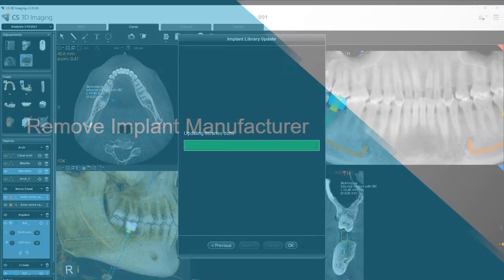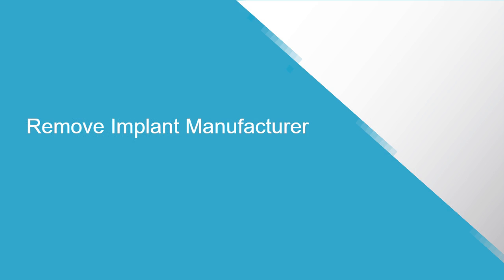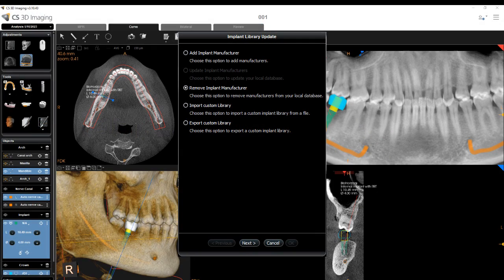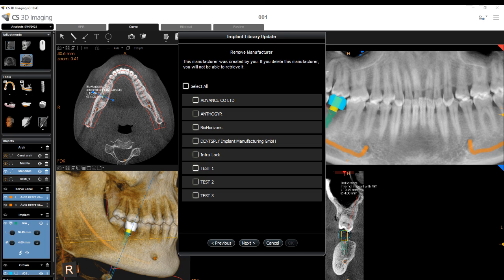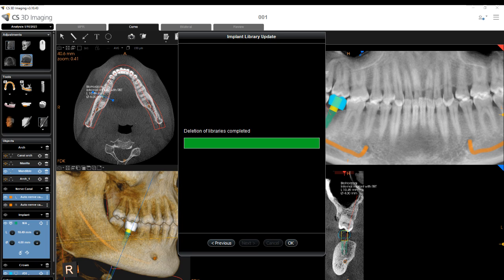Remove Implant Manufacturers: Select Remove Implant Manufacturer and click Next. A list of the installed implant libraries is displayed. Select the manufacturers you want to remove from the computer and click Next. When the action is complete, click OK to finish, or Previous to return to the options menu.